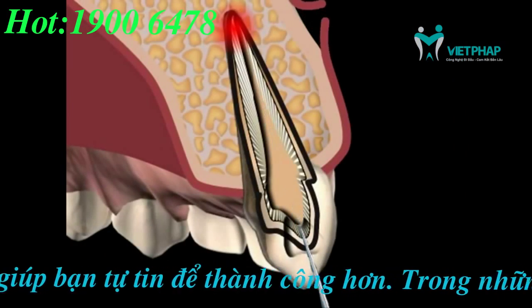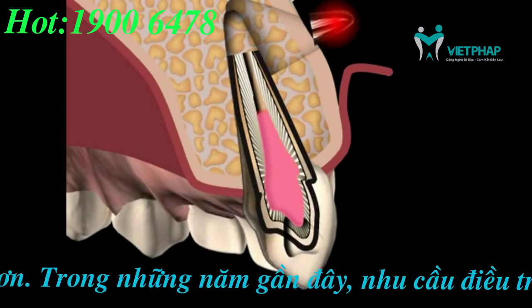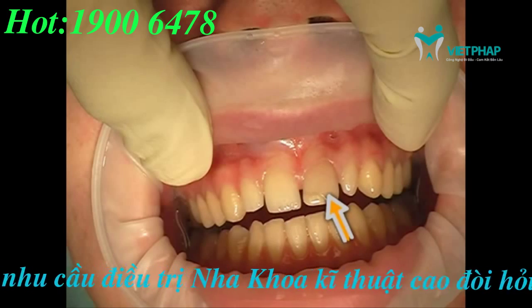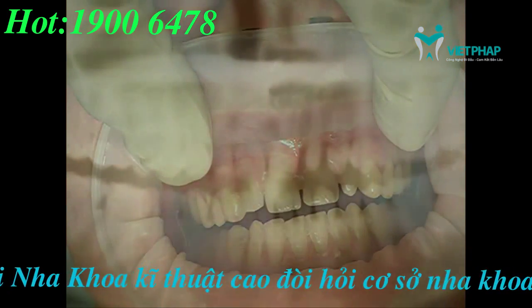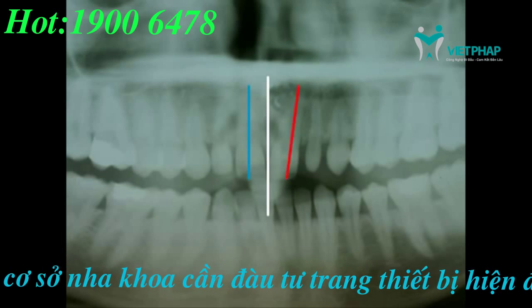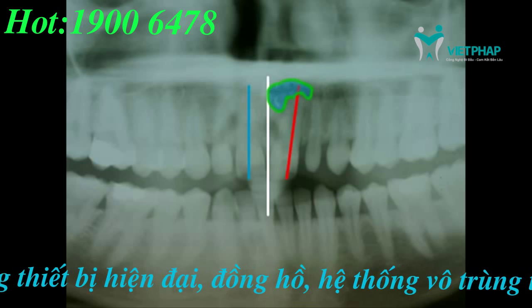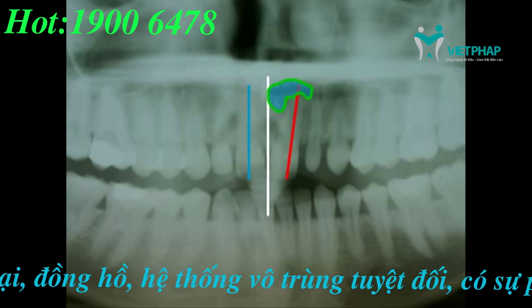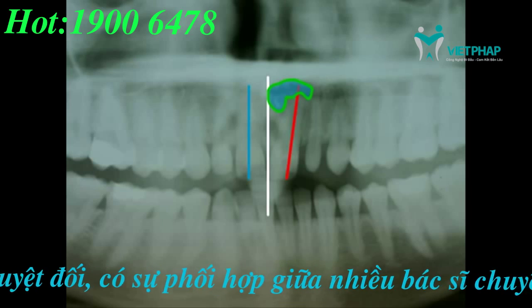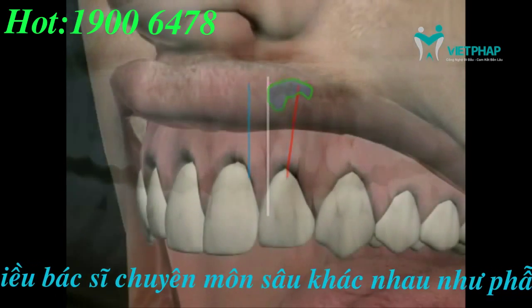Here we see a film of a root tip resection with orthograde filling. The patient fell years ago and injured the left frontal incisor. He did not visit a doctor. And over the years he observed tooth movement away from the center line as well as dark discoloration. The tooth nerve was damaged during the fall and died. The rotting tissue caused an inflammation in the bone, specifically on the root tip, and led to cyst formation.